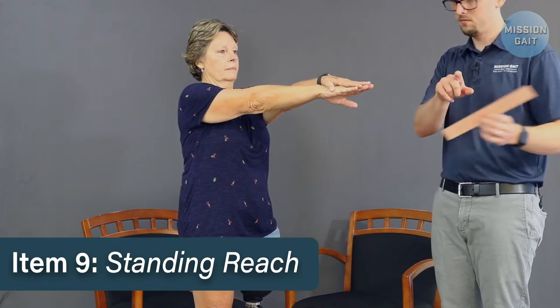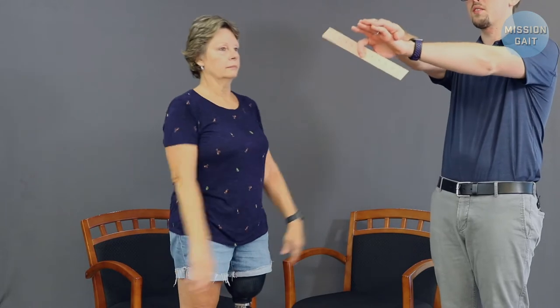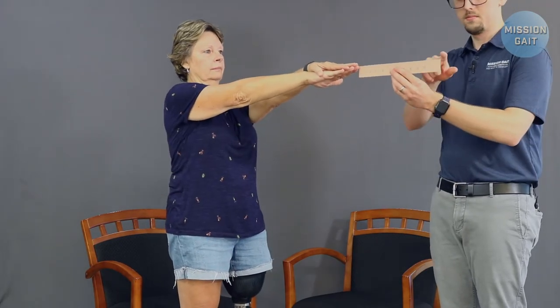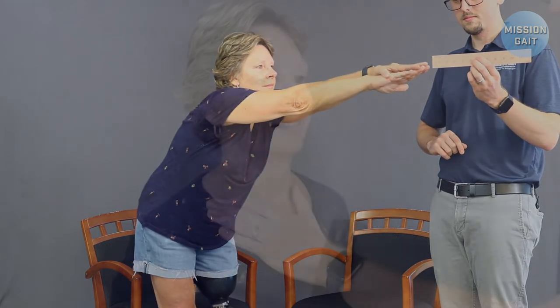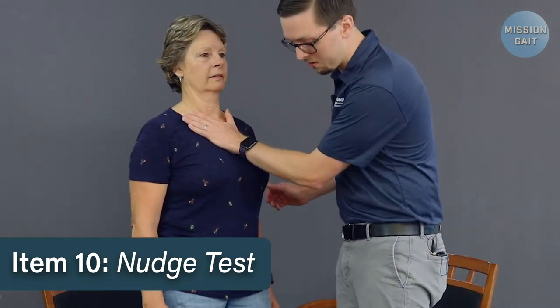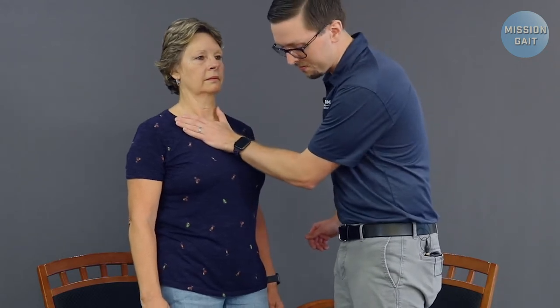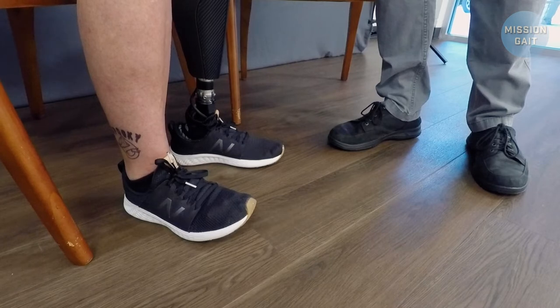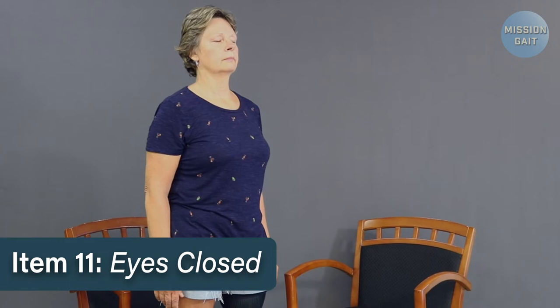Item nine, standing reach. While standing, have the patient extend their arms forward, then hold a 12-inch ruler about 12 inches beyond their extended arms and have the patient reach forward and grasp the ruler. Item ten, nudge test. With feet as close together as possible, push on the patient's sternum three times with the palm of your hand to the point where the patient's toes rise. Item eleven, eyes closed. Have the patient stand with eyes closed for 30 seconds, using an assistive device as necessary.